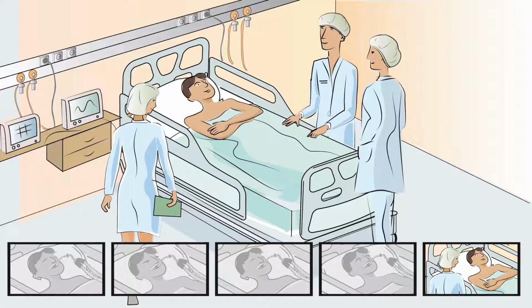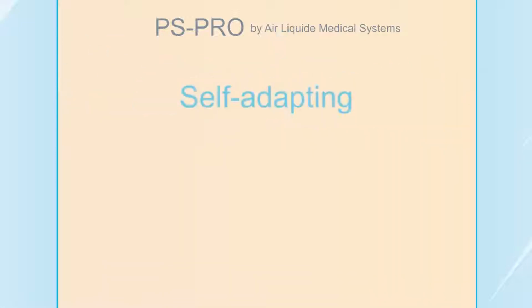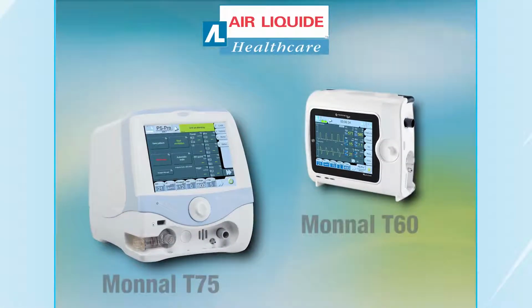PS Pro has offered a smooth and safe recovery to our patient while promoting spontaneous ventilation. PS Pro is a unique mode. Its self-adapting behavior offers safe, continuous, and comfortable ventilation. PS Pro is available both on MT75 and MT60.